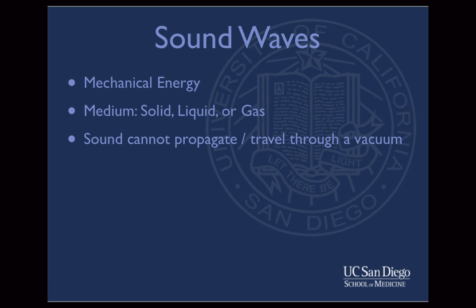Sound waves are mechanical energy which can be carried from one molecule to the next. The propagation of this wave requires a medium, such as solid, liquid, or gas. Hence, sound cannot travel through a vacuum.